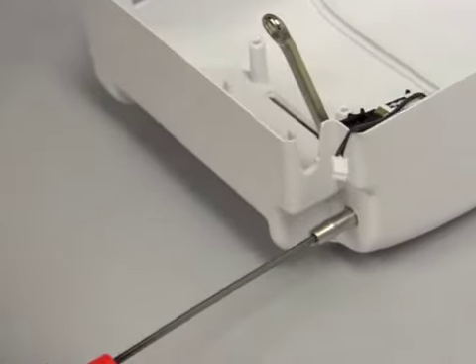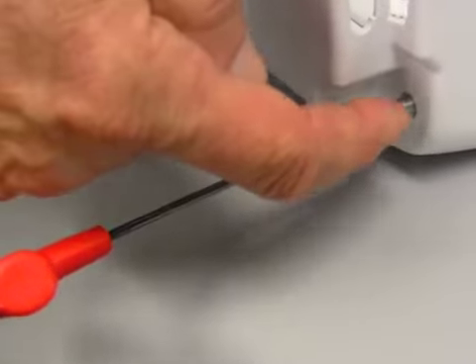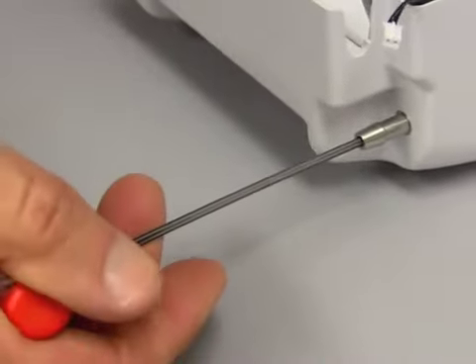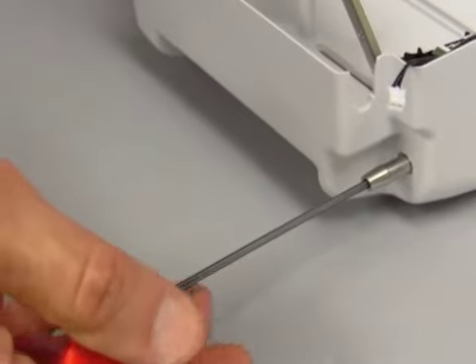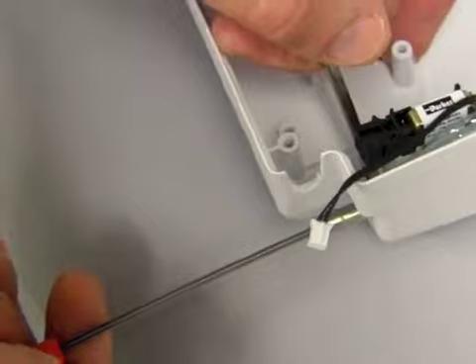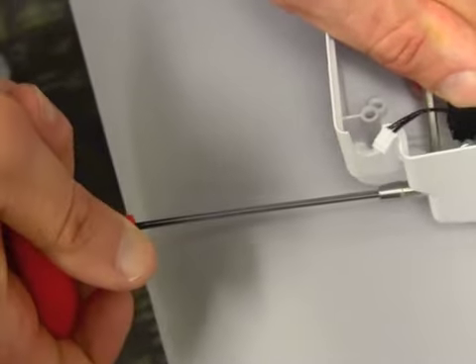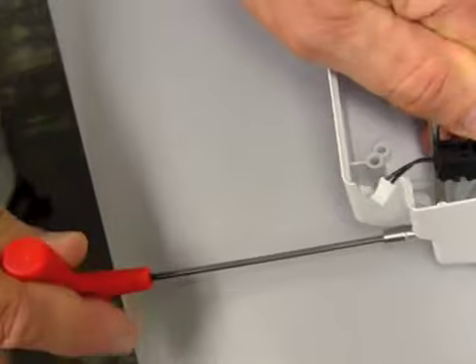Then the 3/32 wrench goes into the hose barb for the cannula. So you insert that in there, and then the 1/4 open end wrench goes on the other end. You hold the 1/4 end wrench and turn the Allen wrench, and you'll hear it break free.